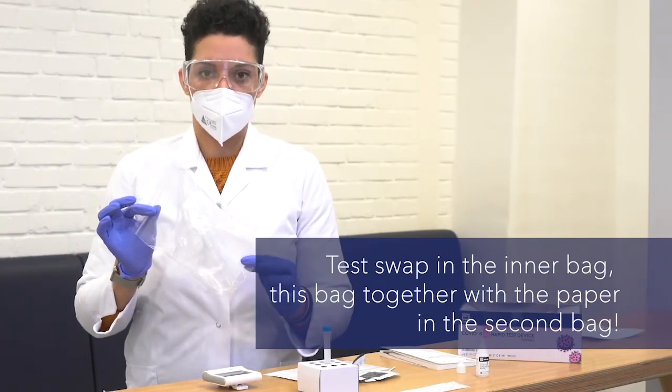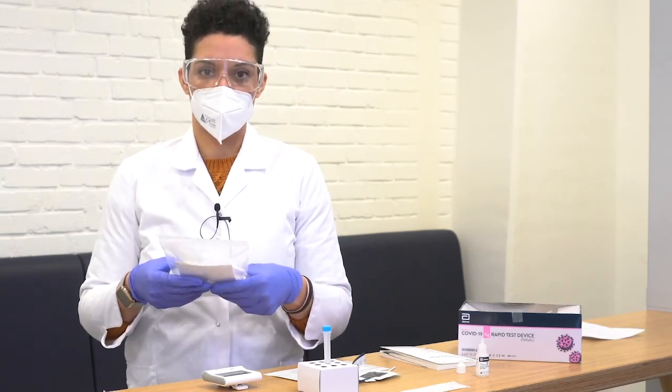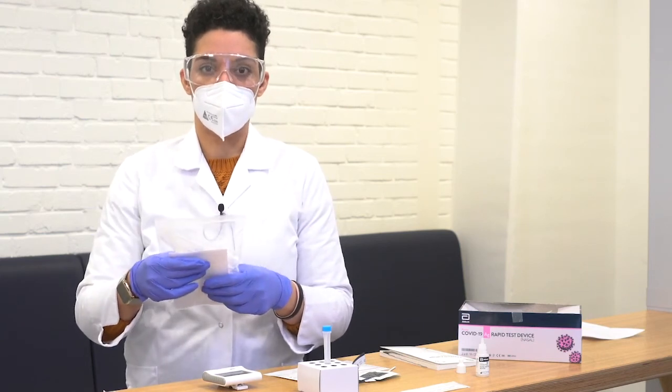So this package then has to be given to us to the Werkstattzentrum. There's a mailbox outside with the corona testing where you can enter it if there's nobody available.